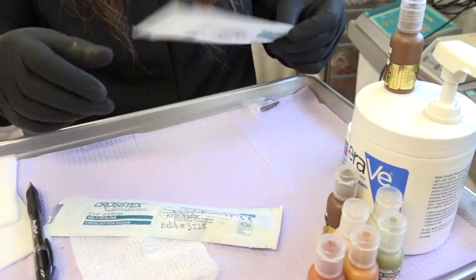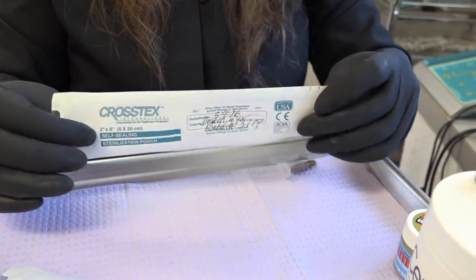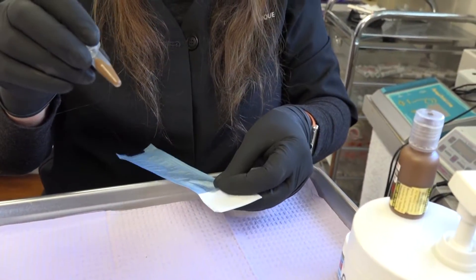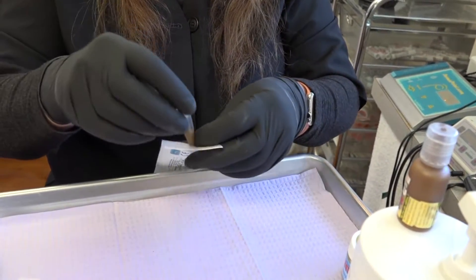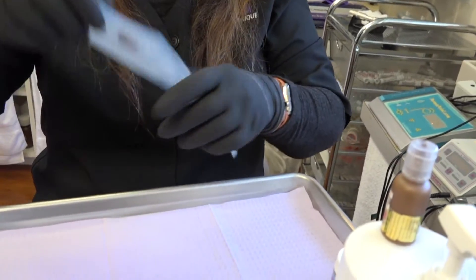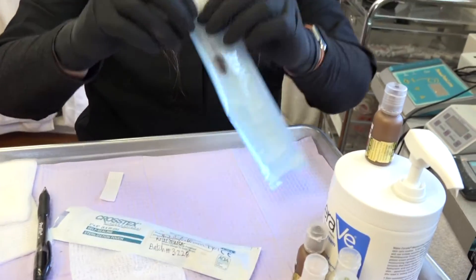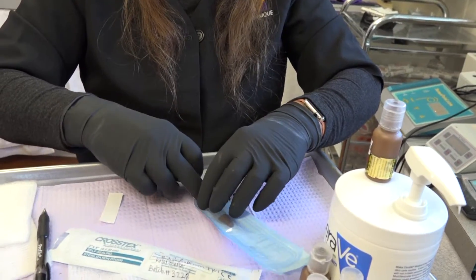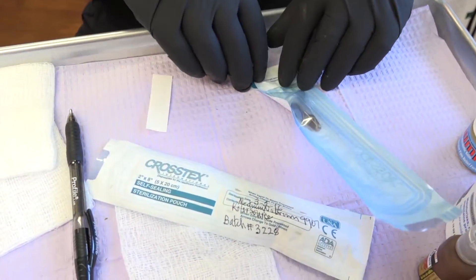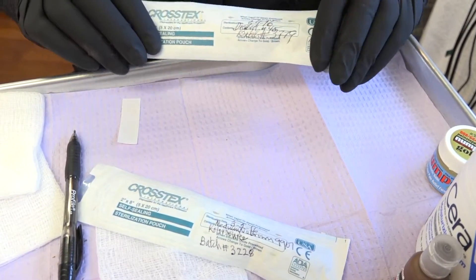Here is your sterilization pouch. Take your pigment — and if you need to label this too, you can put a label on it. Slip it in your pouch, shake it down, and seal it shut.